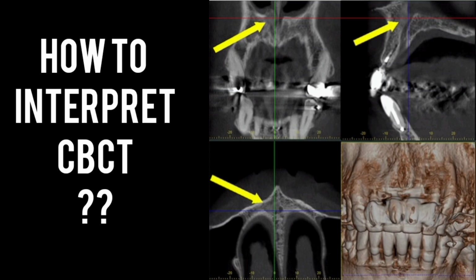What is a CBCT scan? A 3D cone or pyramid shaped divergent X ray beam is directed through the patient onto a detector. During exposure, the X ray generator and the detector rotate around the patient's head. Scan time can be as fast as 5 seconds to 20 seconds.